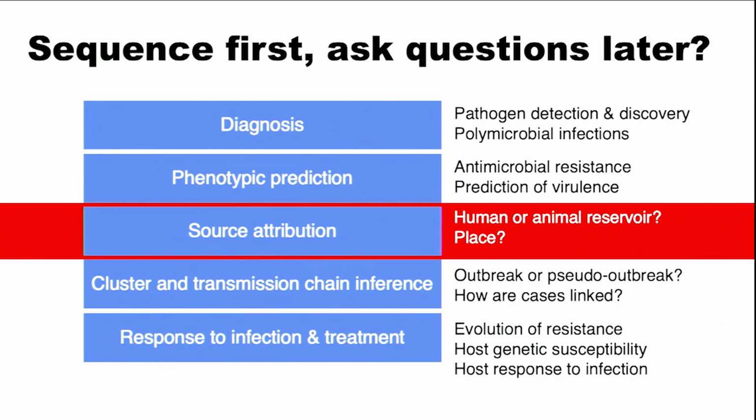We're just going to do sequencing in clinical microbiology when a patient presents and we are concerned that they have an infectious cause, or maybe even a non-infectious cause. And Charles will talk about this. And the reason I think sequencing is going to be an important test in clinical microbiology as a first line is because only sequencing, through generation of genomes and comparing genomes, gives us so much rich information that is useful for a clinician or useful for an epidemiologist, and in fact useful for biologists and people that study evolution.